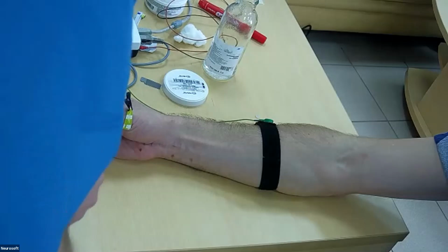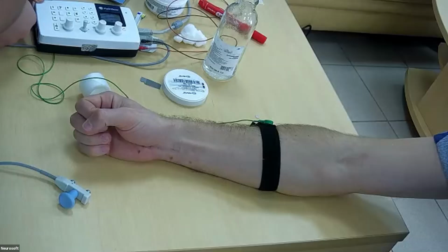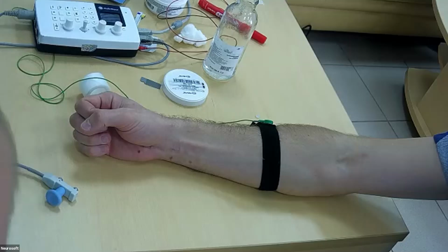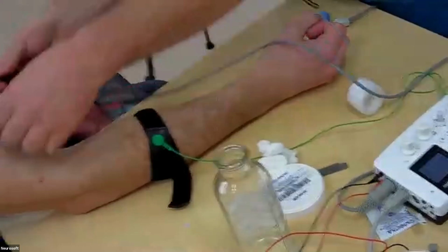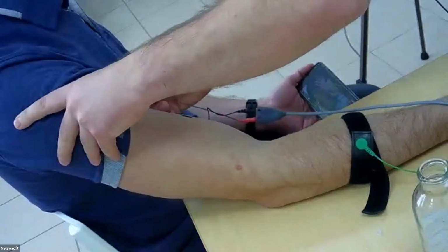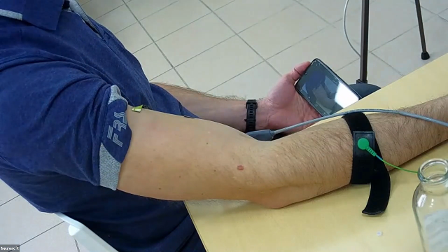We will use the biceps reflex, the bicipital reflex, and we need to set electrodes at the biceps: the active electrode at the middle of the biceps muscle, and the reference at the level of the biceps with the deltoid.